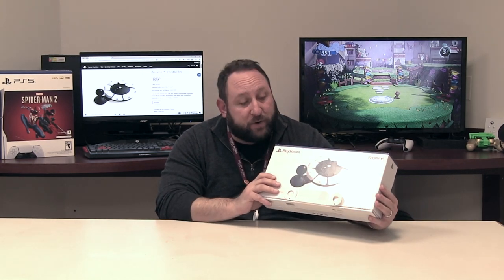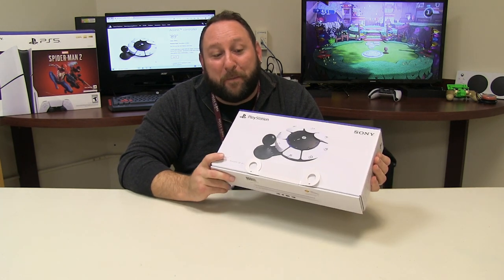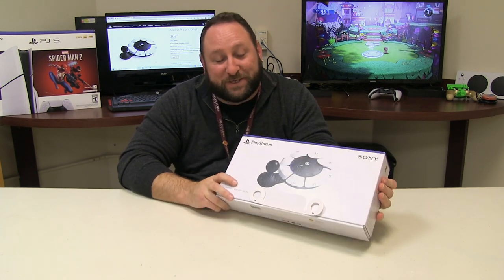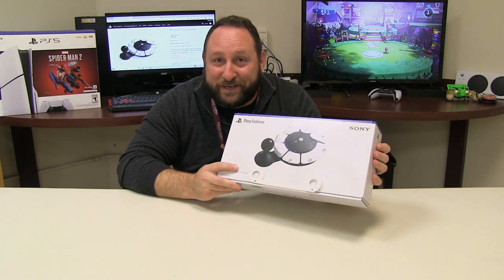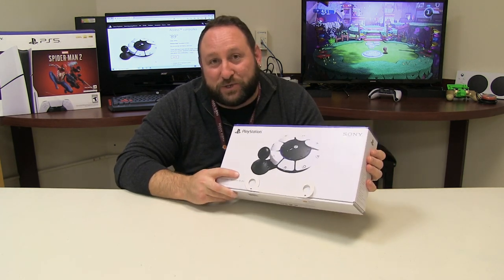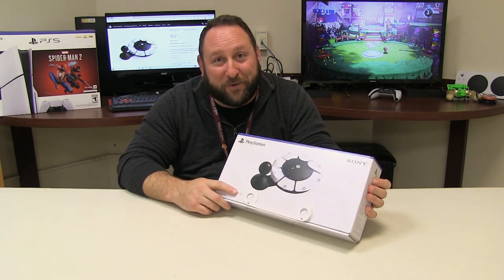We're going to do an unboxing, show some of the stuff that's in here, and then a little bit on the PlayStation to show you what you can do with it. We received our Access Controller, and while the shipping package was not accessible to somebody with limited hand function, Sony did go through great lengths to make sure that once you received your fun gift in the mail, you can open it.